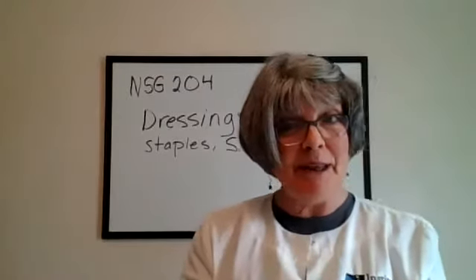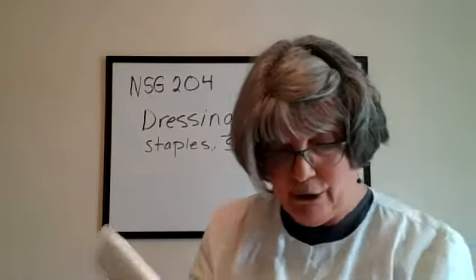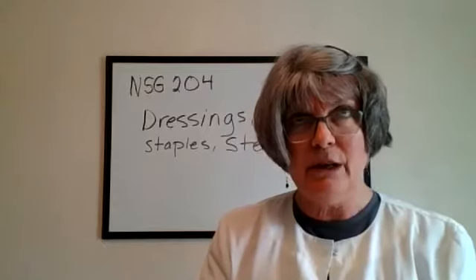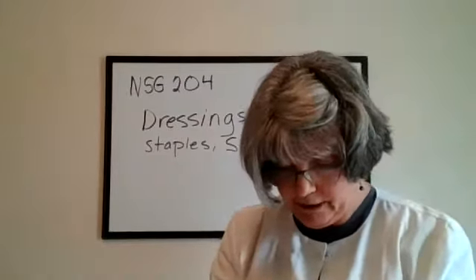I believe that we put some of these in your bags if you had the privilege of coming to pick up a bag of supplies. So you probably have had a chance to look at these already. They cover a large area. There are two different sizes. This one's 7 by 8. I think the other one is a 3 by 5, but they are larger dressings that cover a large area.